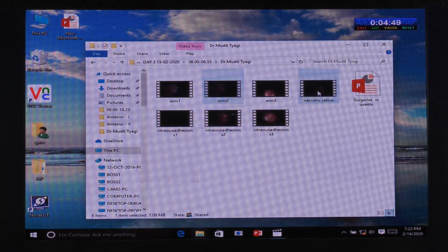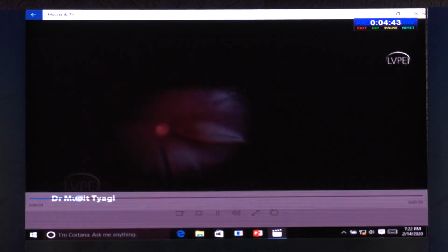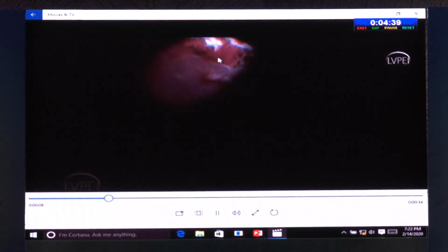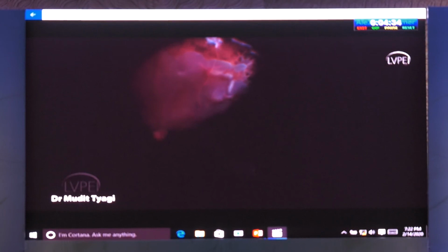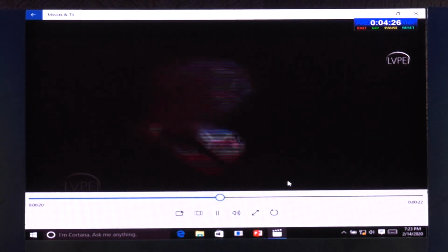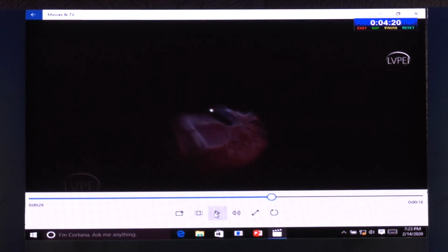Apart from that, one more problem which you face is the peripheral necrotic retina. The retina in these cases is totally necrotic. You will see multiple patches of necrosis and peripheral breaks, and these are the areas from which the detachment occurs. So you have to be careful even while you're doing a vitrectomy. If you try to induce a PVD or try to pull too much, you will end up creating more breaks than you would otherwise be hoping for. So be careful about the peripheral necrotic retina, because that is something you need to handle. You can truncate or shave your vitreous over here instead of doing anything else.